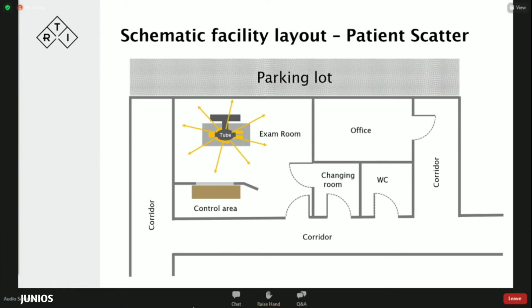The fluence and the quality of this scatter radiation have angular dependence, and it doesn't have the same intensity in all directions. When we look into the procedure for measuring scatter, that will make sense as to why we are saying that the fluence and the quality of this scatter radiation have an angular dependence. So we'll go back to that concept later.